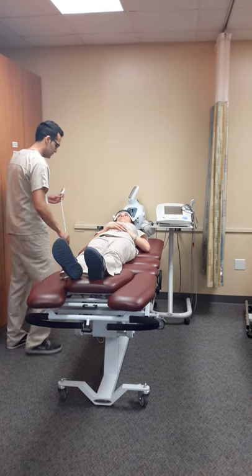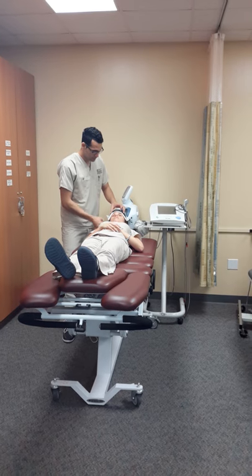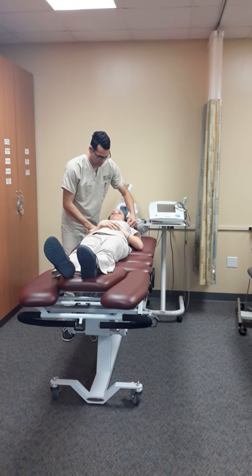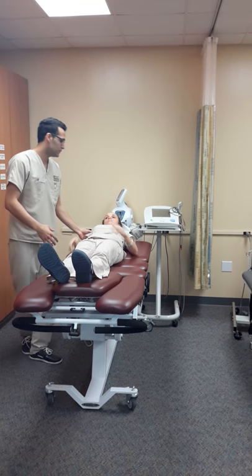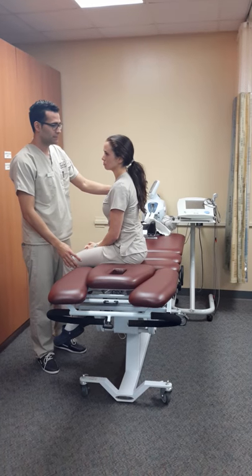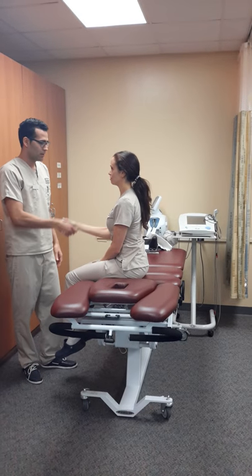So how's everything, Mrs. Diaz? Good. So let me just remove the harness. All right, go ahead and sit up for me. Is that easy? It's fine. So how was the treatment for today?